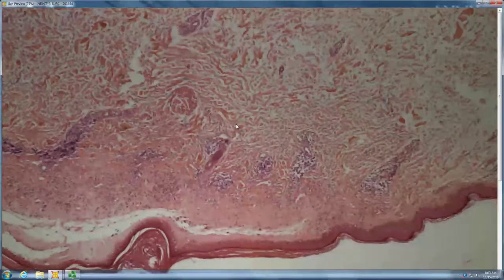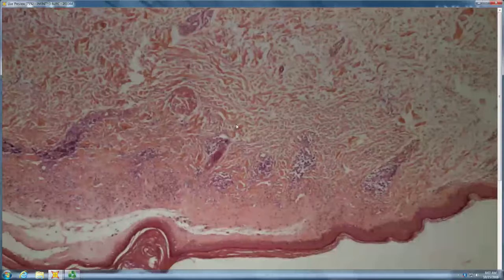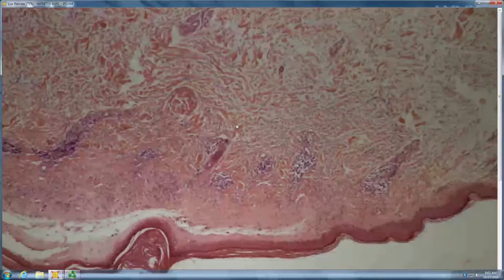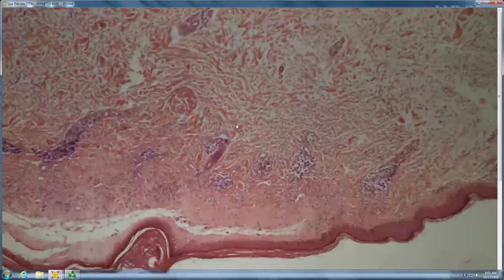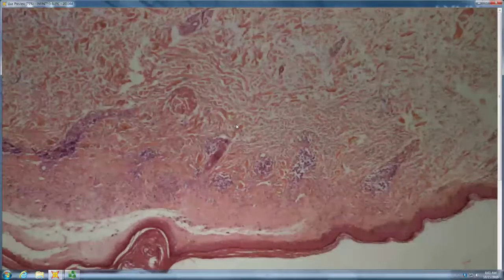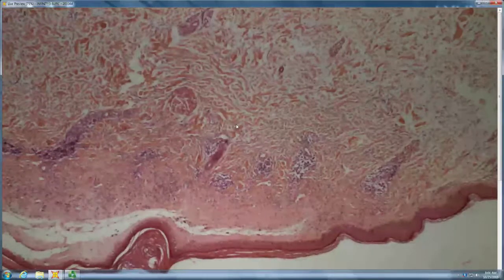How would this histology differ from radiation dermatitis? You may have radiation fibroblasts. What else? Lymphoid band completely lacking in radiation dermatitis, ectasia of superficial vessels, radiation elastosis that forms vertical columns where the hair follicles used to be, and an absence of adnexal structures. Right. So those are all the things that differentiate radiation dermatitis.